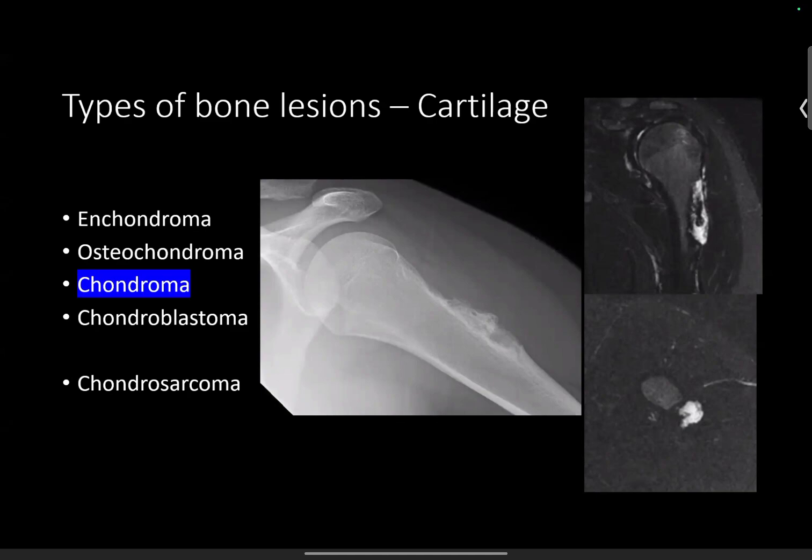For benign lesions, you probably could skip the MR if you feel confident on the X-ray. When we talked about lucent lesions, whether they could be cystic or solid, I find MR is very helpful. If you're not sure if it's cystic or solid, MR is very useful because a cystic lesion is going to have a T2 bright rim enhancing, whereas a solid lesion, of course, is going to have some solid enhancement.